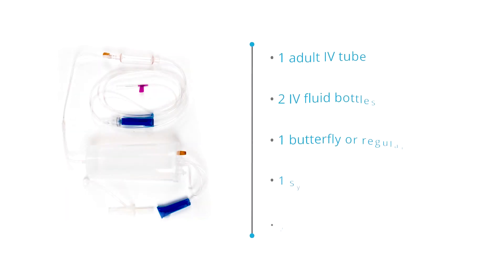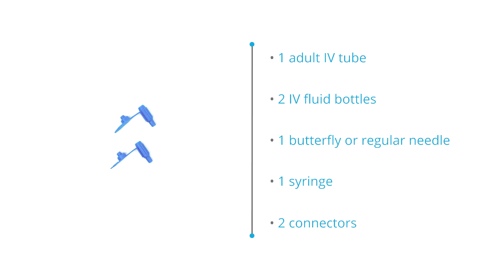The IV practice arm includes one arm with two clips, metal stand, one adult IV tube, two IV fluid bottles, one butterfly or regular needle, one syringe, and two connectors.